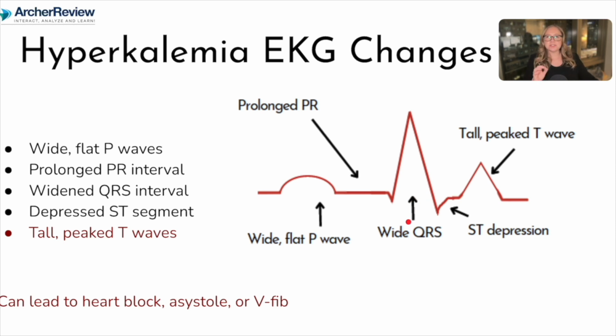Lastly, the most important finding of hyperkalemia in an EKG is your tall peaked T wave. This T wave, representing ventricular repolarization, is usually pretty shallow and rounded, and in hyperkalemia, it's going to be tall and peaked.